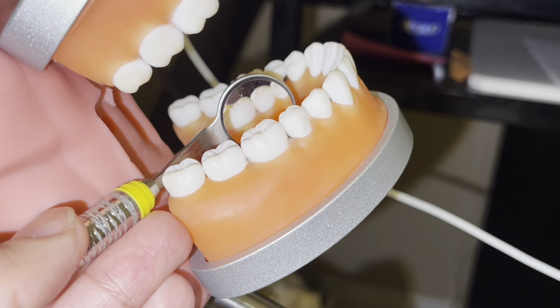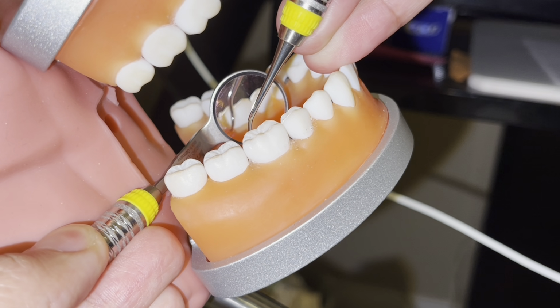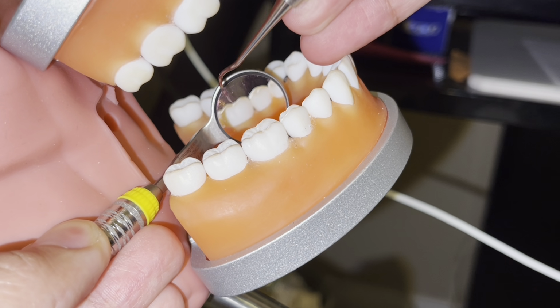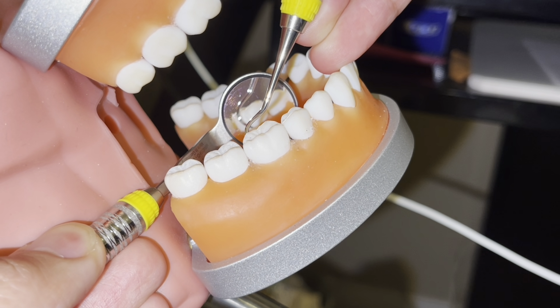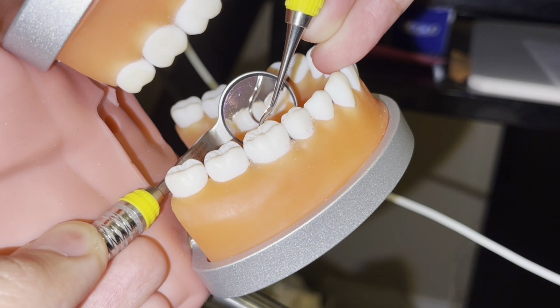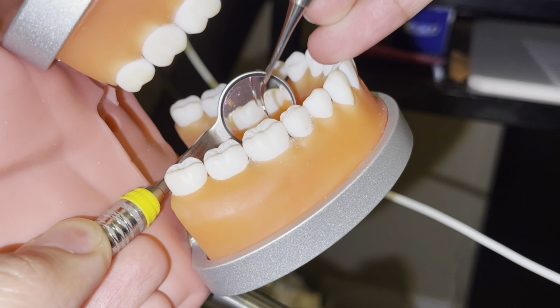Okay, so next I will be scaling teeth numbers 29 and 30 lingual aspects. Starting at the distal lingual line angle, I will go side to side, and in the proximal, go up, down. Turn your instrument halfway. Starting at the distal lingual line angle again, side to side, pivot roll, side to side, pivot roll, side to side.